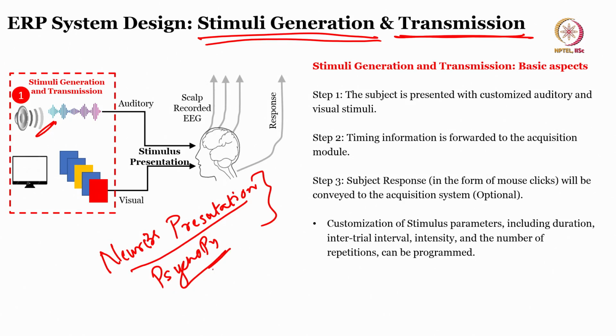If you are working with images, you should have a proper image set for a visual experiment. And when you talk about auditory sound, there is something called Audacity. It is another software which you can use to generate different sounds, different tones, different clicks, different chirps. All these are known as auditory stimuli. Okay, what are these? Click, chirp, tone, etc. You can explore on your own.